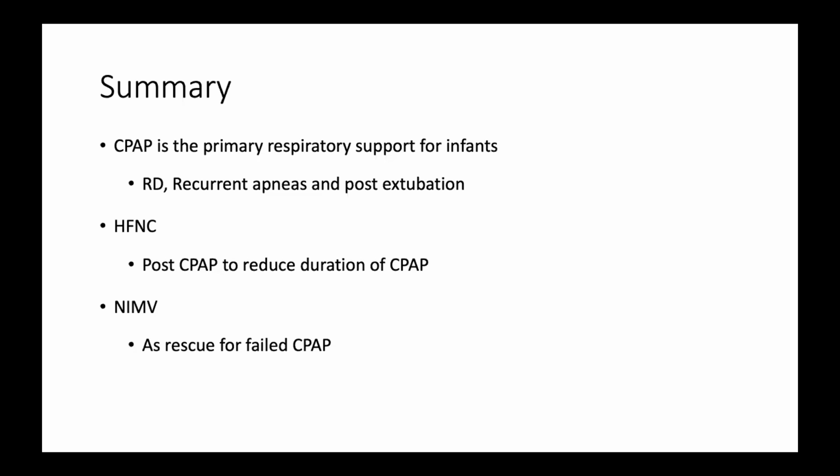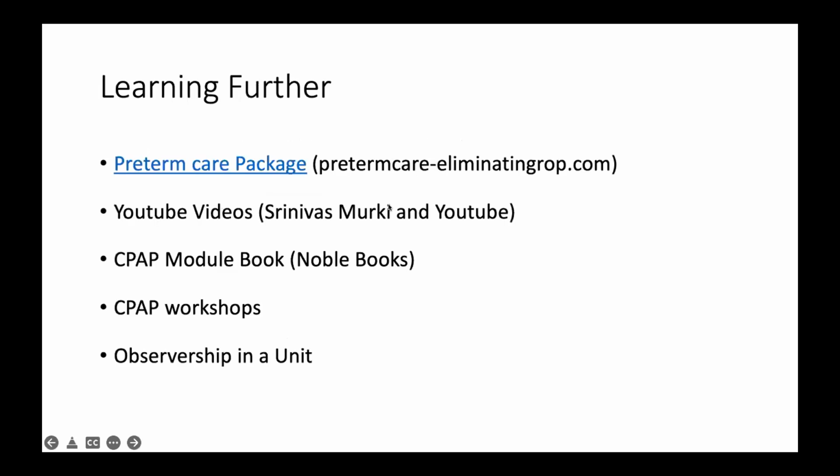Nasal IMV, some countries use it as a primary mode, but it is not the cost-effective way. And the training and the usage of nasal IMV is definitely much higher compared to training of the nurses for CPAP. So if you still want to learn further, please go to a preterm care package.